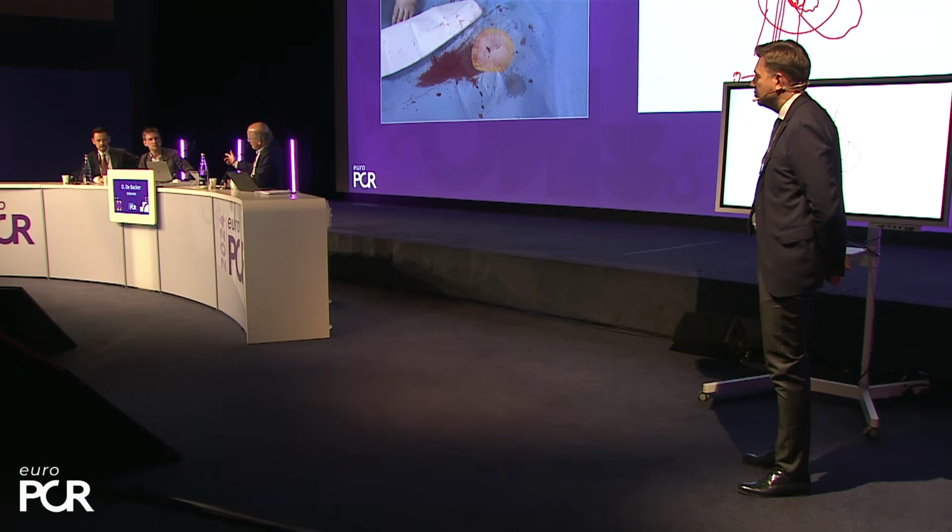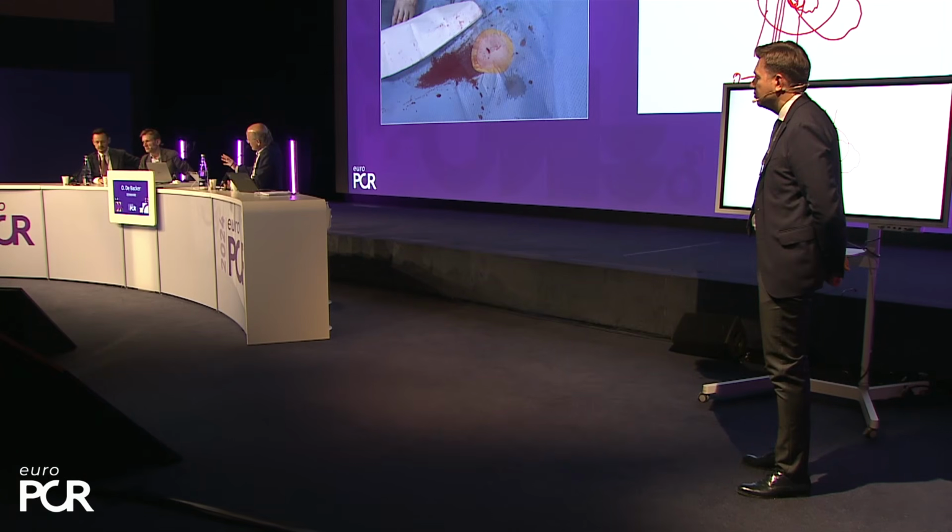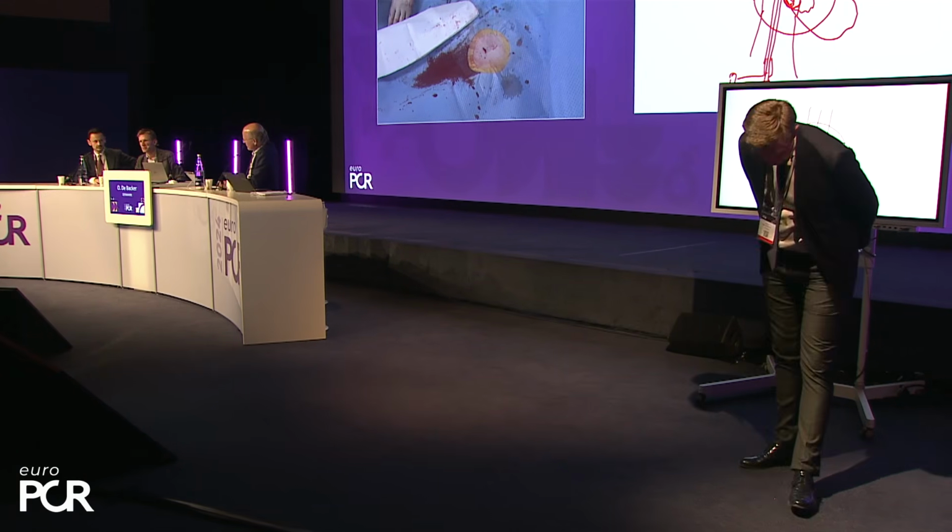That's the question. Answer. We have only some seconds. 1 or 2 systems? Do you routinely take 2 systems or only 1? It depends. I mean, that's depending on what you're using. If you feel extremely safe with your first deployment and you do not have a TAVI device which demands a very large access, then it could be sufficient with 1. But if you feel insecure or you feel more safe with 2, I think you should go for 2.